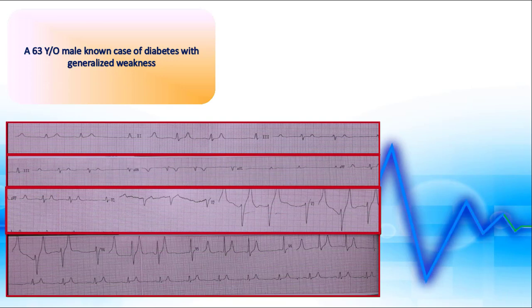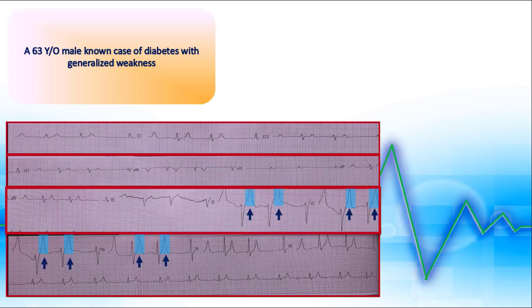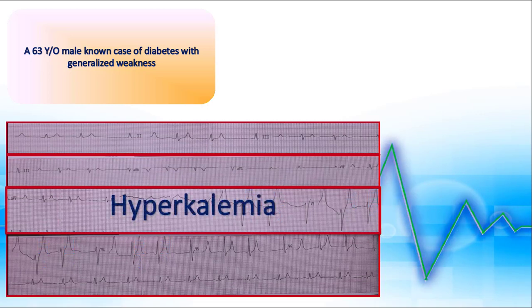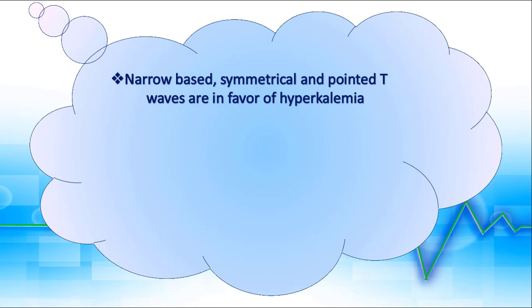The last example in this part is an EKG from a 63-year-old male, a known case of diabetes presenting with generalized weakness. There are symmetrical, narrow-based, and tented T waves in precordial leads — therefore hyperkalemia is highly probable in this patient. Serum potassium was 7.6.